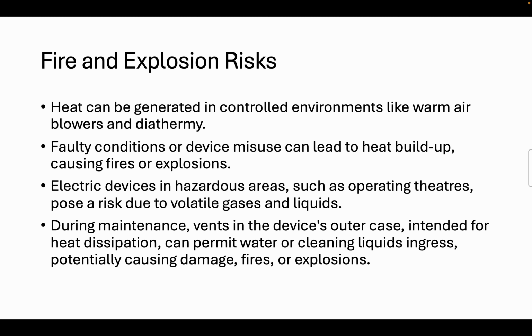So consider the use of electrical devices in hazardous environments, such as operating theaters, where gases and liquids are present. This can cause fire and excessive heat to build up, which could easily ignite in the presence of an electrical fault, at worst causing a fire or an explosion.